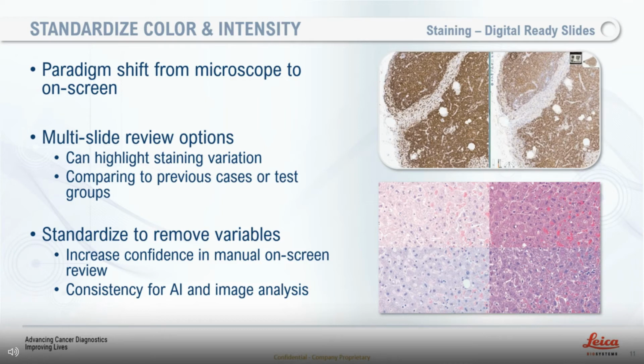That is going to emphasize any staining variation that you may have within your tissue preparation. And you want to be able to have the confidence to say that the staining you're looking at is true staining, and that, for instance, in the example shown here, that is a variation in staining, and that the tissue on the left-hand side does have a higher expression profile, and that this isn't to do with manual variation in staining, that I didn't leave it to bind as long as I needed to.